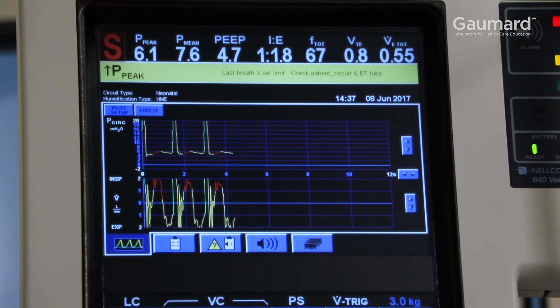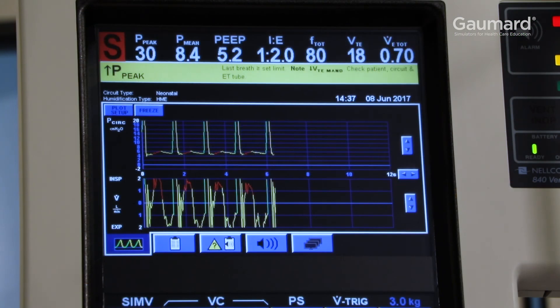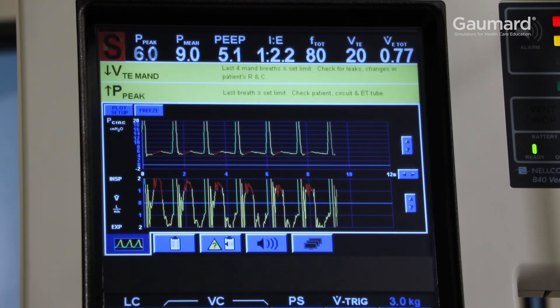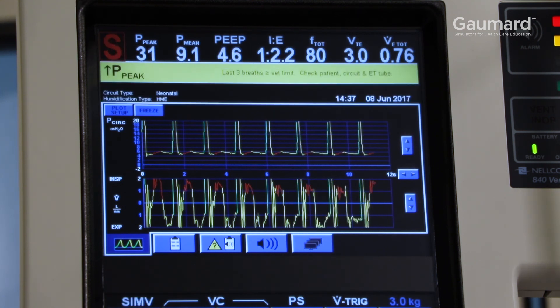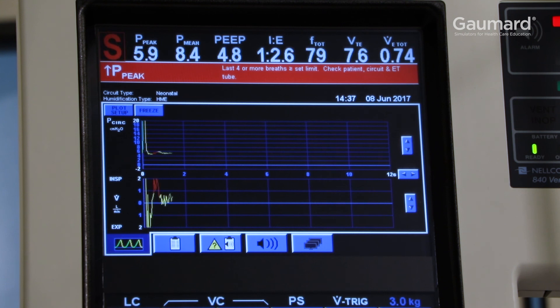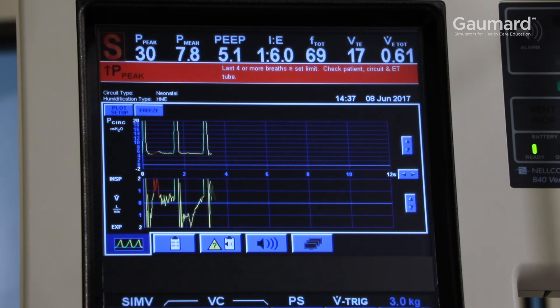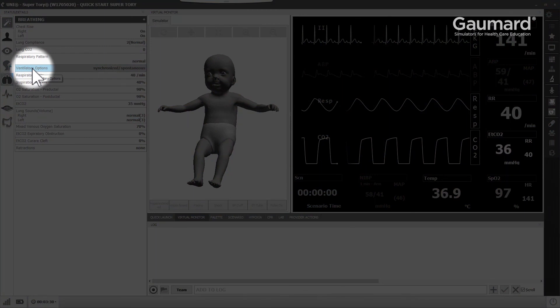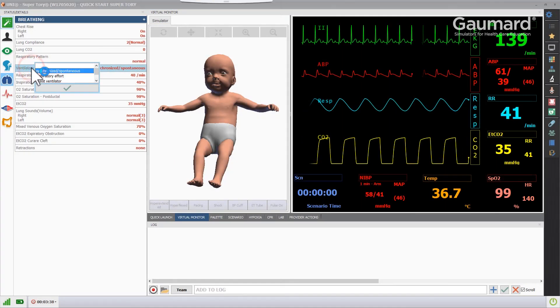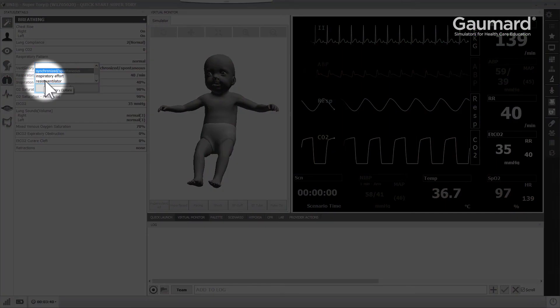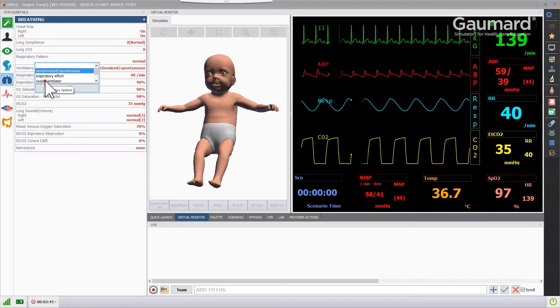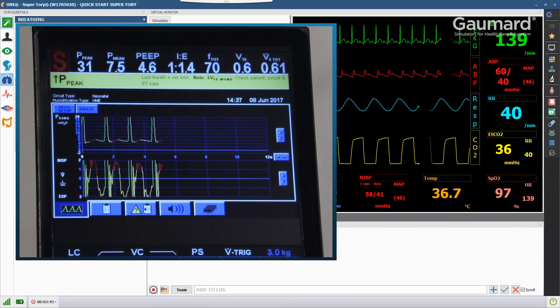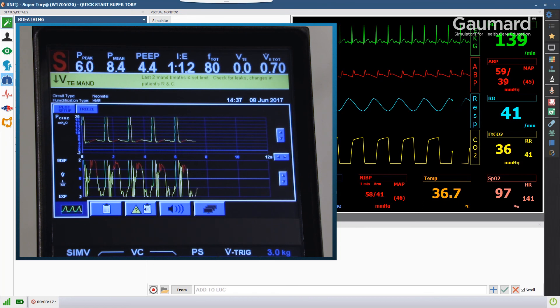This automatic programming can be overridden to simulate a patient not sufficiently sedated or resisting and bucking the mechanical ventilator. Click the ventilatory options vital and select 'Resist Ventilator' to override the automatic programming. SuperTori will breathe at the rate, pattern, and inspiratory percentage at all times, even during ventilation.